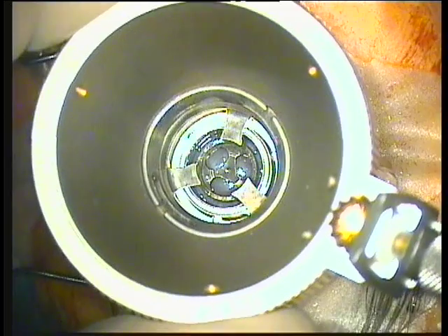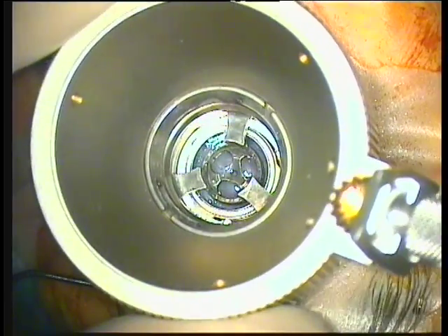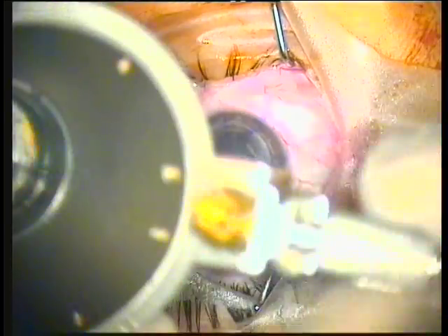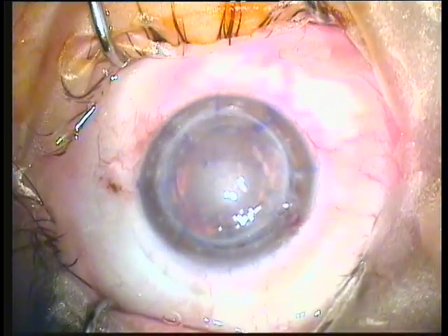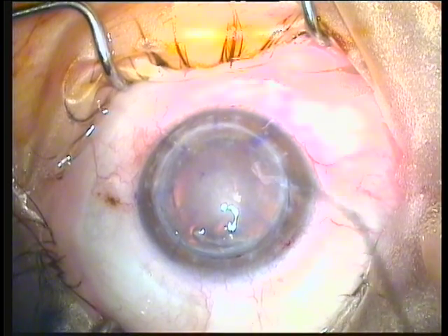You can see here the Hanna trephine by Moria used to trephine the host cornea to a diameter of 8.25 millimeters. This is done at a depth of about 600 microns. Remember, this is a bullous keratopathy failed corneal graft with a thickness probably over 700 microns at that peripheral point.